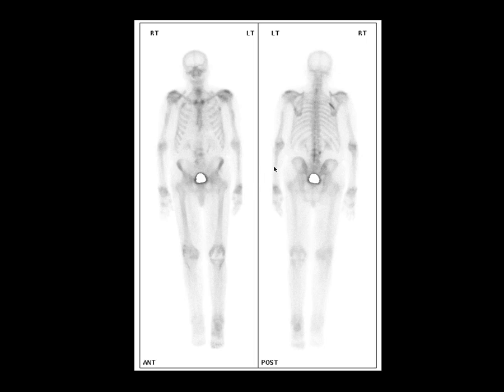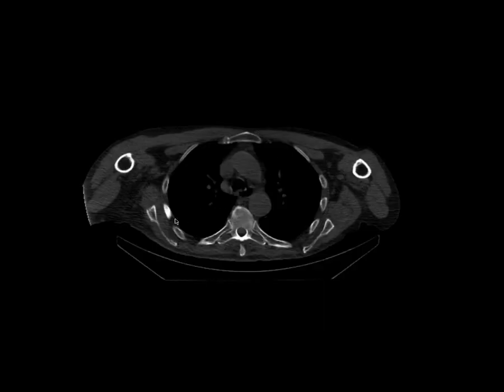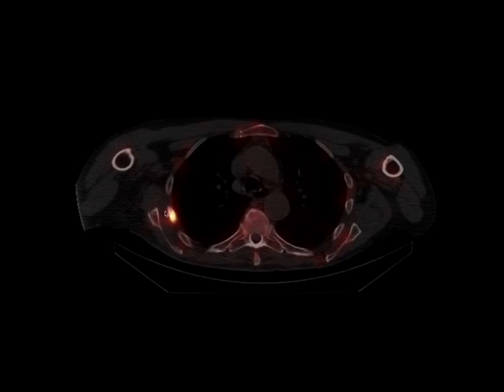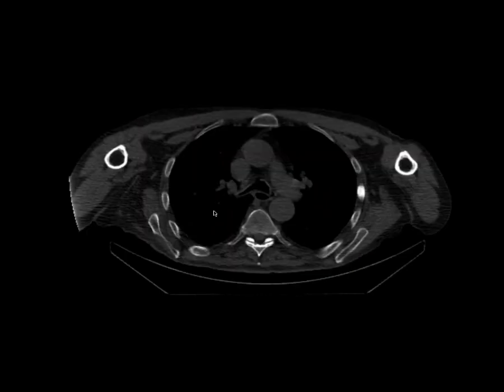Here's a patient with a rather linear focus of increased activity and another faint area nearby. The SPECT component shows increased uptake, and the CT component shows dense sclerosis, which is common in osteoblastic metastases — commonly seen in prostate cancer and breast cancer. The fused SPECT CT allows us to call this a metastatic deposit with a high degree of reliability. The other side similarly shows sclerotic density in keeping with metastasis.